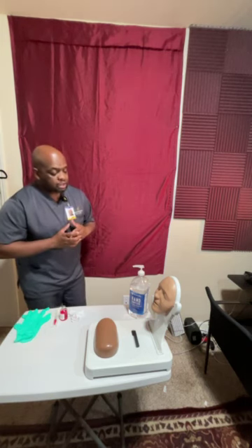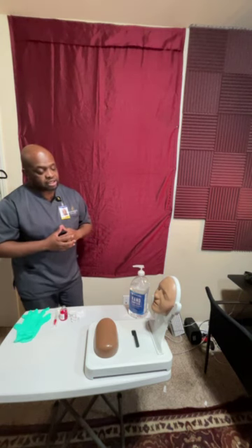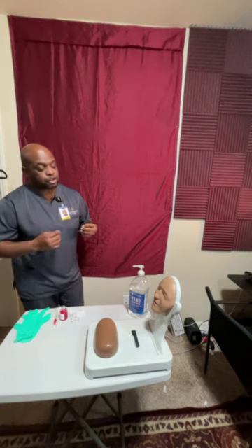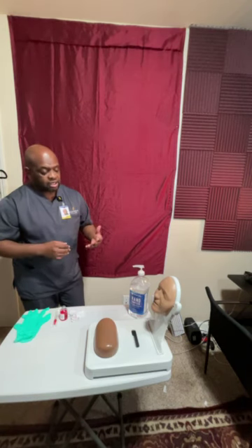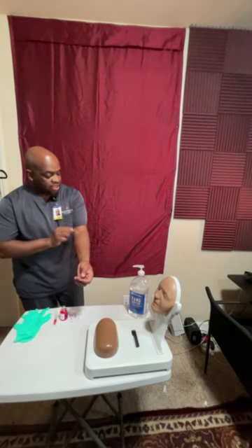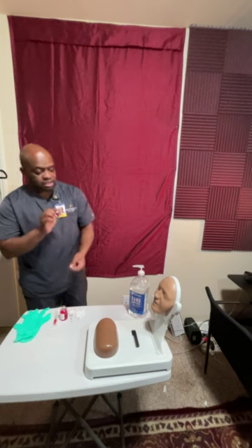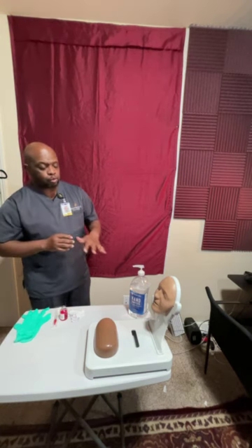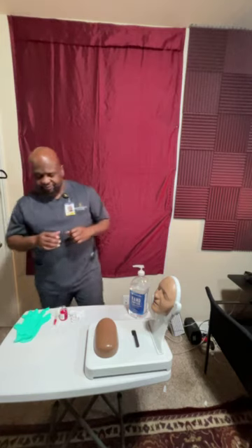Hello, Mr. Jones. My name is Robert. I'm a student of Nightingale College. I'm here because your doctor would like you to have a tuberculosis skin test, and the way that's done is we will be giving you an injection of tuberculin medication. It's going to be a skin test, an injection right up under the epidermis. It's going to be right there in the skin. It's going to be leaving a little bubble there. But before we begin, I'm going to go ahead and wash my hands and provide you some privacy, okay?